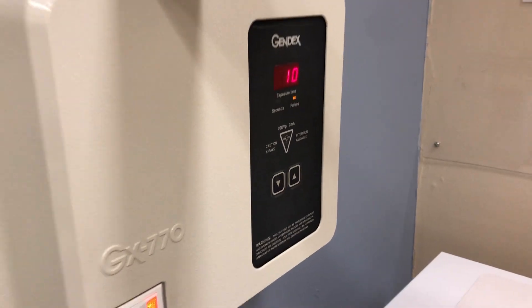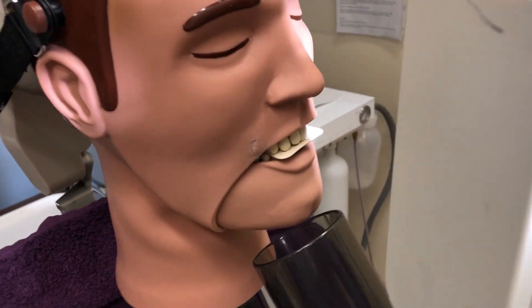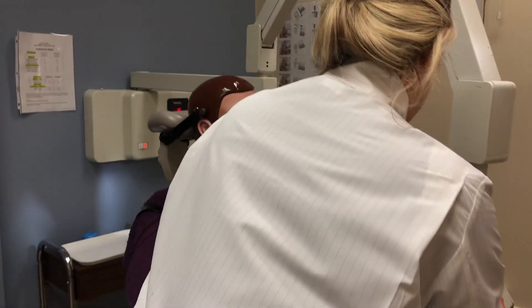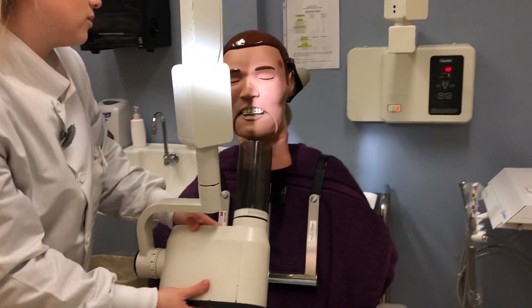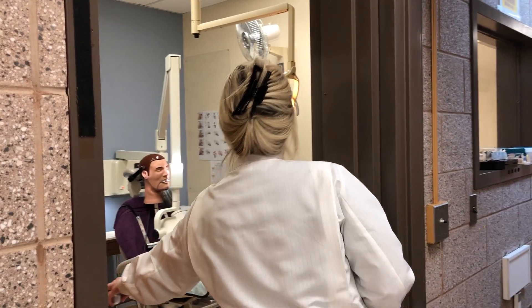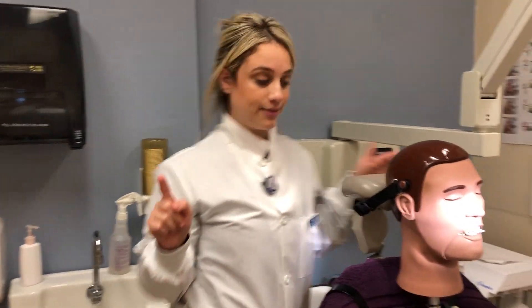Now we are moving on to the PIDO exposure. The exposure time is at 10, and again you're going to make sure that your vertical angulation is at negative 55, and you are using the size 2 film for the PIDO. Everything is pretty much the same — you just want to make sure that the exposure time is set for a pediatric dentition.